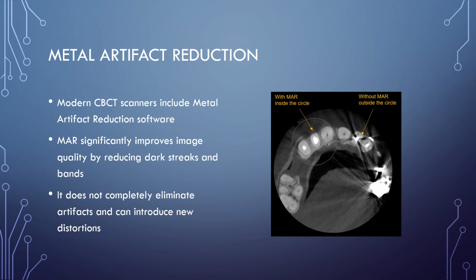However, it is absolutely critical for clinicians to understand that MAR is not a perfect magic solution. It does not eliminate artifacts completely, and the aggressive algorithmic correction can sometimes introduce new, more subtle distortions into the image, meaning you must still evaluate the area with a highly critical eye.